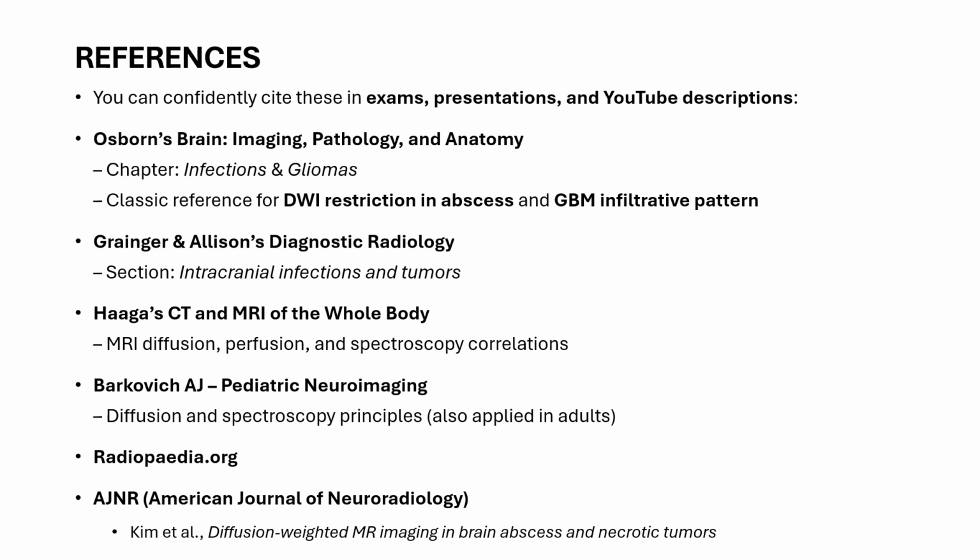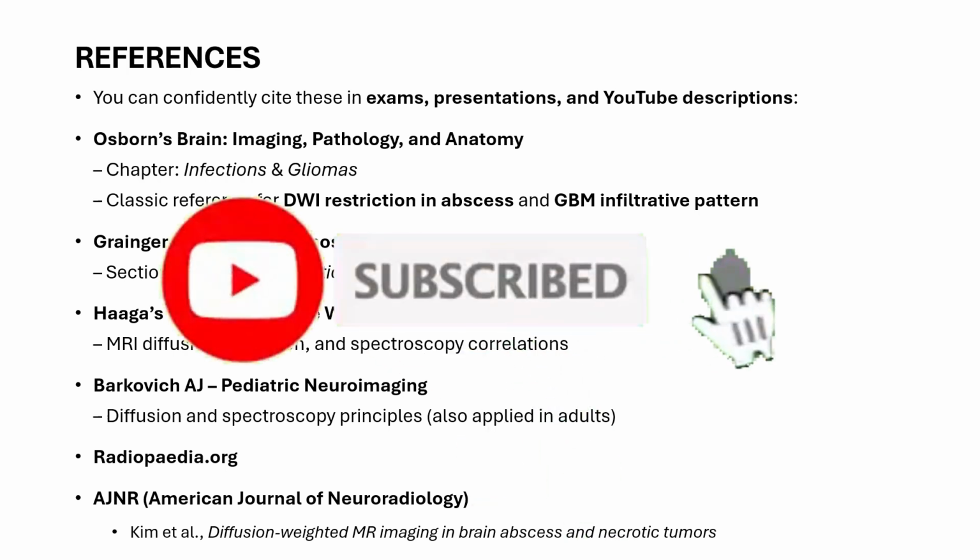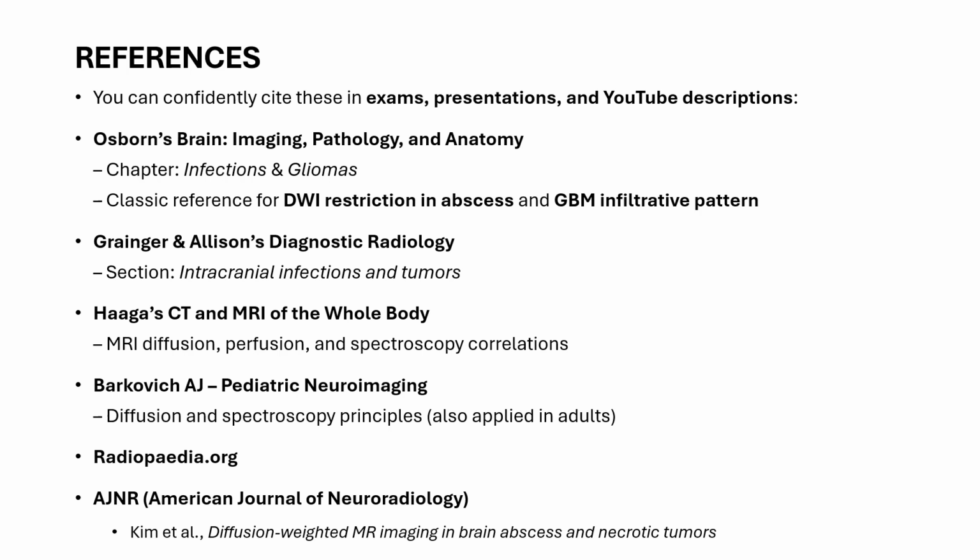And remember, ring enhancement is not a diagnosis, it's a pattern. If you systematically analyze location, size, wall thickness, edema, and MRI patterns, you can confidently differentiate abscess, GBM, tuberculoma, metastasis, and NCC. That's all for today's session on ring enhancing brain lesions.